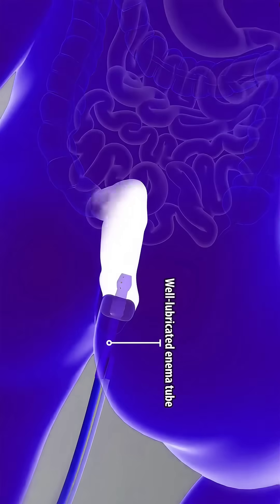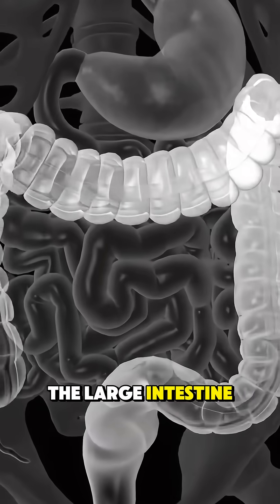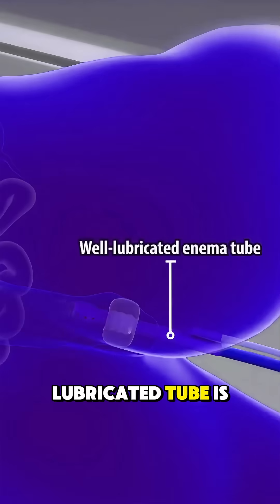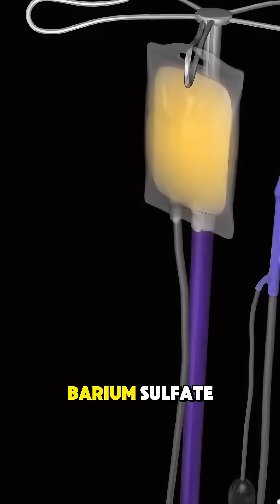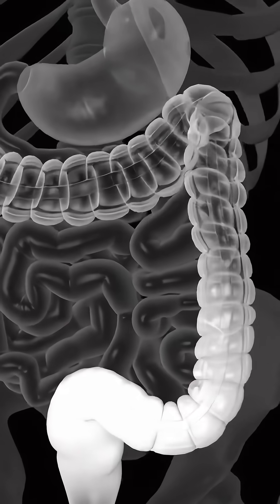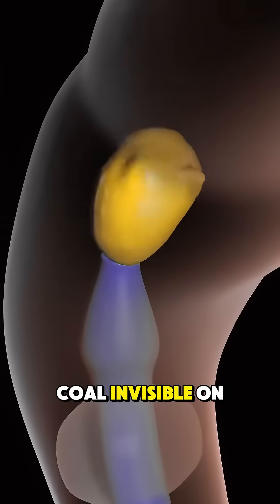Ever heard of a barium enema? It's a special x-ray test that helps doctors see the large intestine. The patient lies on an x-ray table and a small lubricated tube is gently inserted into the rectum. A liquid called barium sulfate is slowly introduced into the colon, coating the intestinal walls. Why barium? Because it's a contrast dye that makes the colon visible on x-rays.